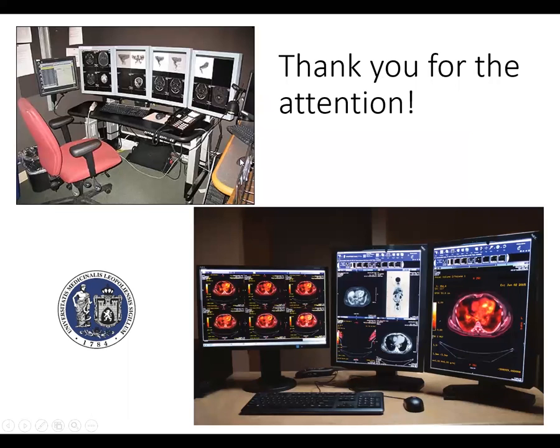In the end, I want to show you what the real workspace of the radiologist looks like, because we have 4 monitors here, 3 monitors here, because in case of hybrid imaging we must assess the computed tomography, overlap on each slice, fusion imaging with the PET or SPECT imaging, and different slices. So the same slice may look different on different phases of the scanning. So it's a very sophisticated method of examination, and this is very useful in contemporary medicine.